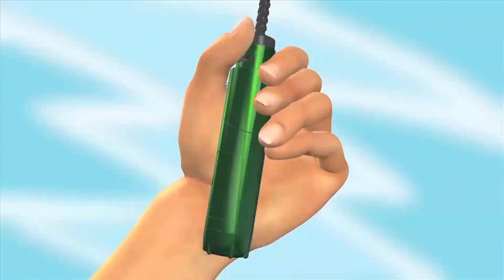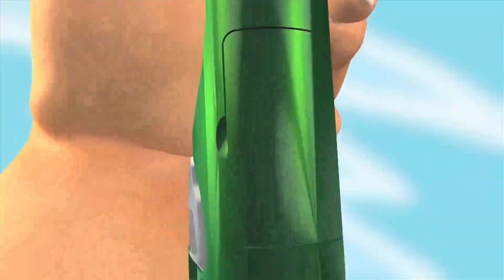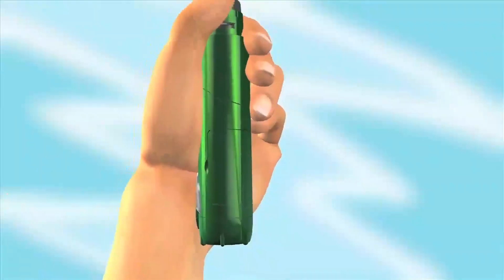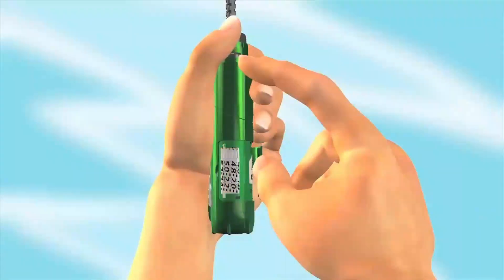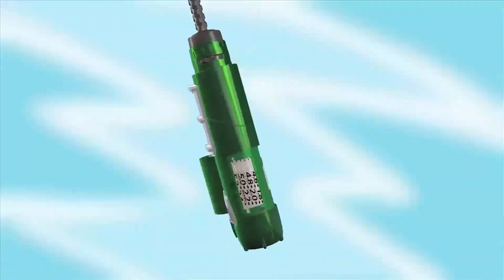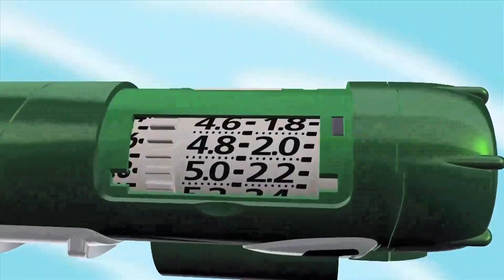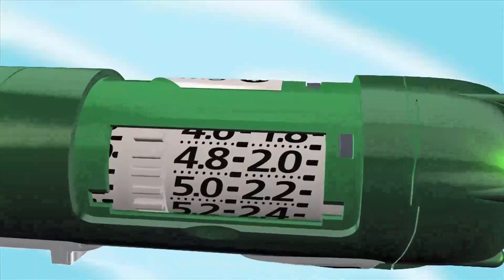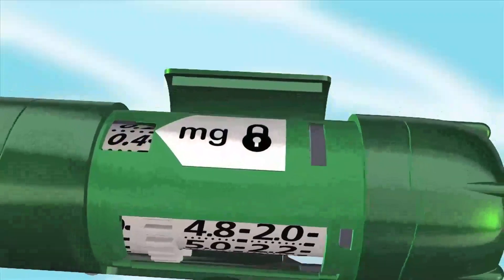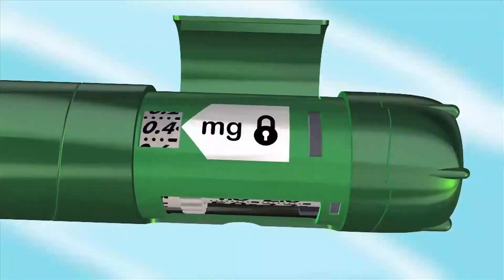Start preparing your SurePal by setting the dose memory. To open the dose memory lid, put a fingernail in the notch and push up — it's usually easiest to use the nail of your thumb. Underneath the lid you'll see a wheel with notches and some numbers next to it. Turn this wheel to set your dose memory.